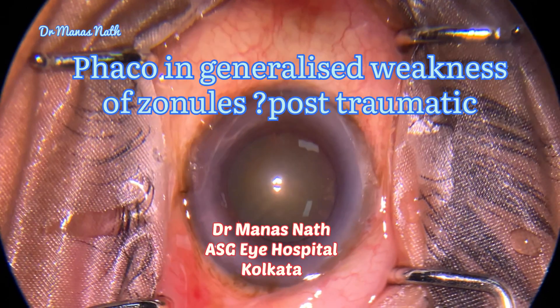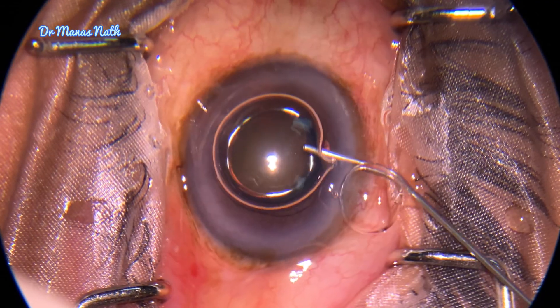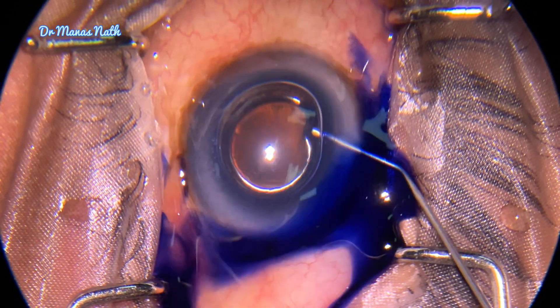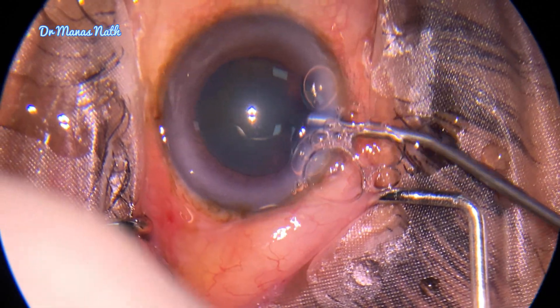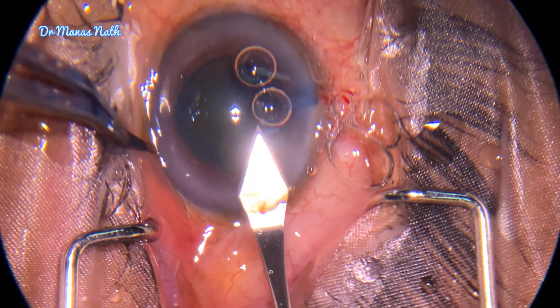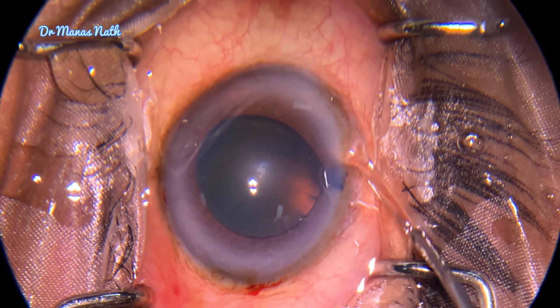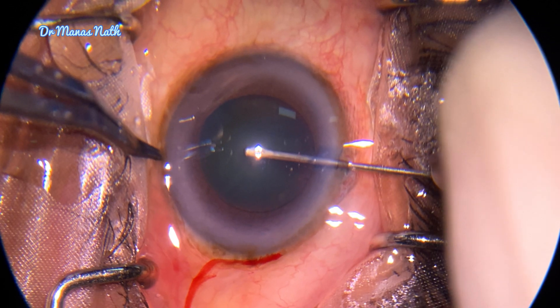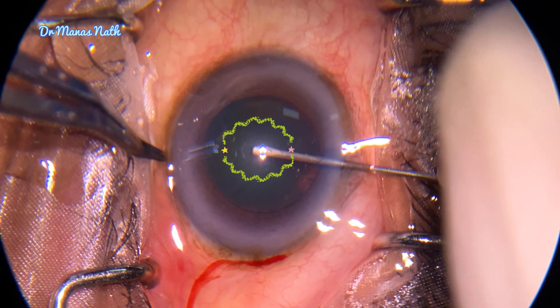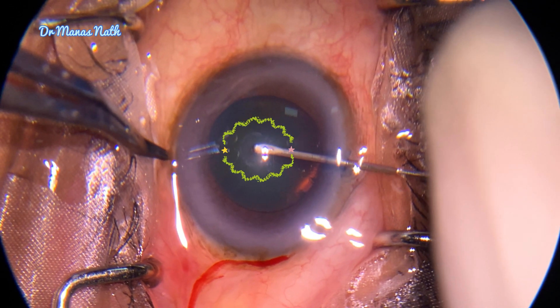Hello everyone. This video is on a phaco in generalized weakness of zonules — probably post-traumatic. Neither the patient told me he had a history of trauma, nor could I see any phacodonesis under slit lamp. I actually noticed the weak zonules only during the incision of the capsulorhexis. Here you can see the pincushion effect.